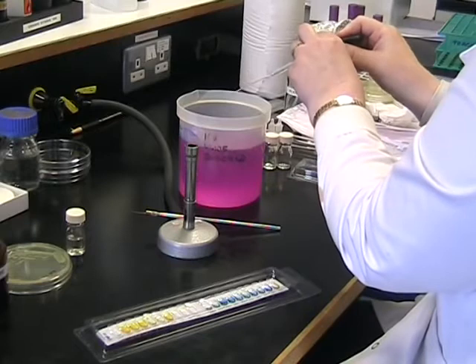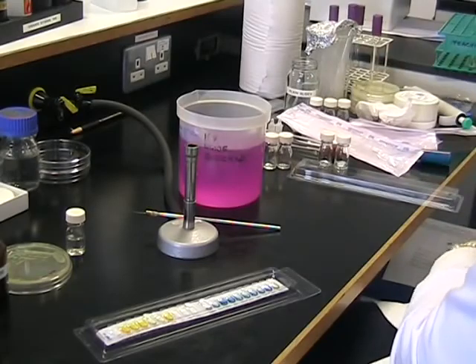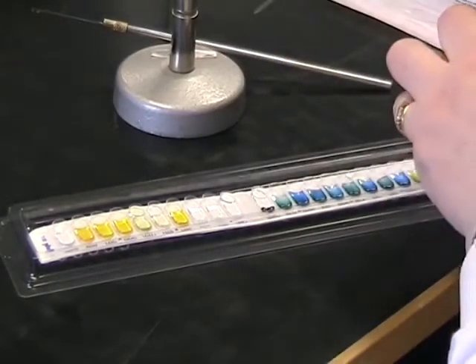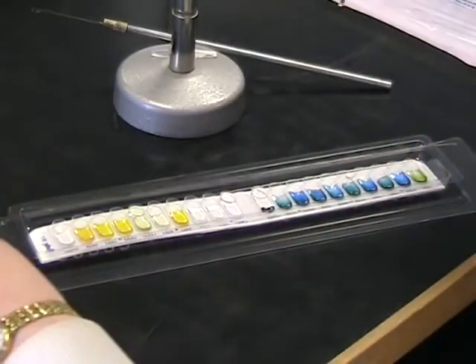When you finish filling your strip with the bacteria, make sure you discard your pasteur pipette into the pot of chloros provided. We're now going to overlay the cupules that are underlined with some mineral oil. This will exclude the air and create anaerobic conditions.